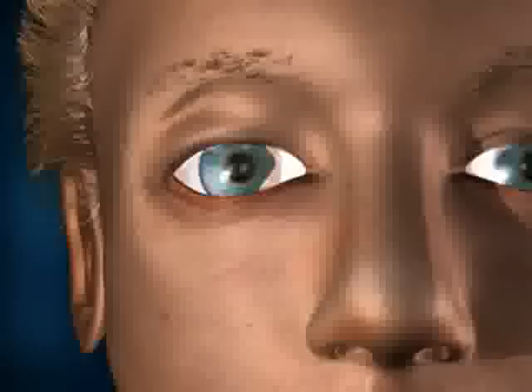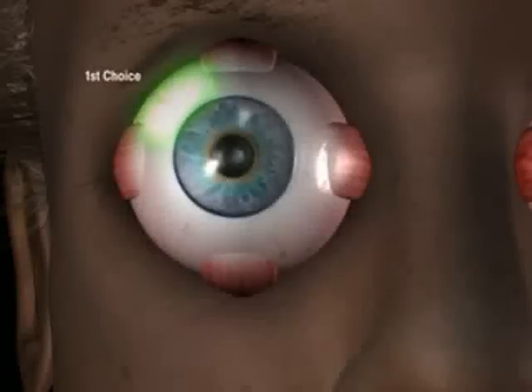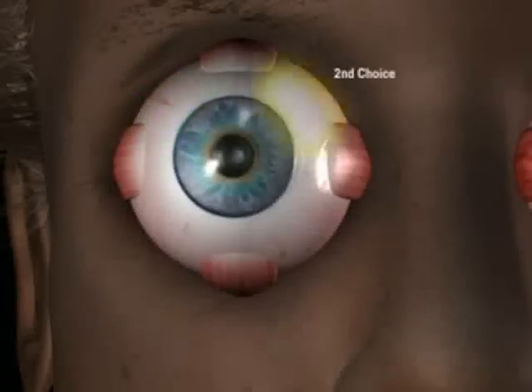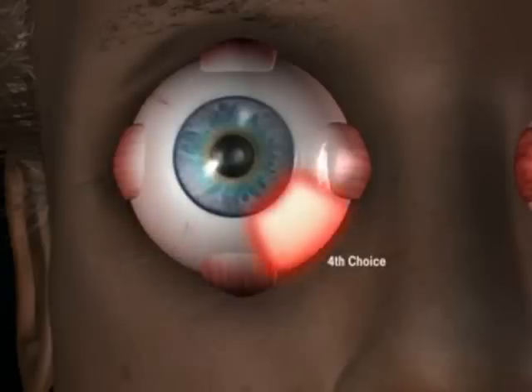Forming a pocket. Where should the valve plate be placed? First choice, superior temporal quadrant. Second choice, superior nasal quadrant. Third choice, inferior temporal quadrant. Fourth choice, inferior nasal quadrant.